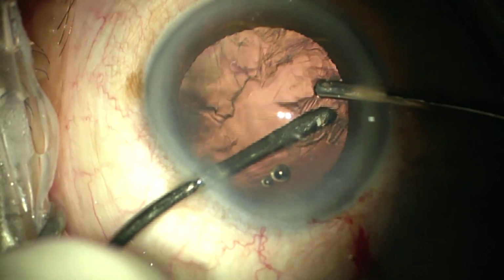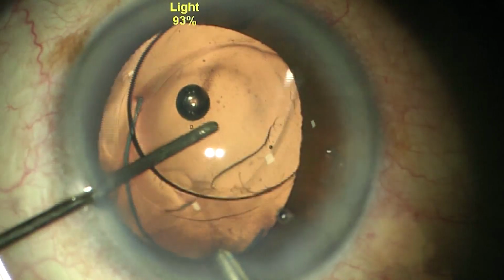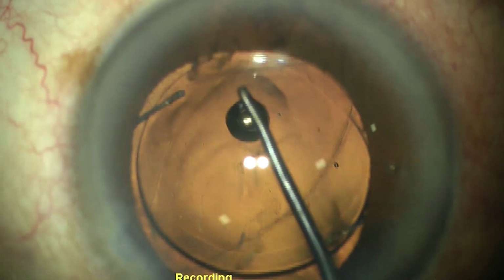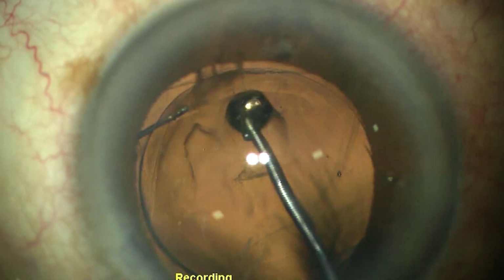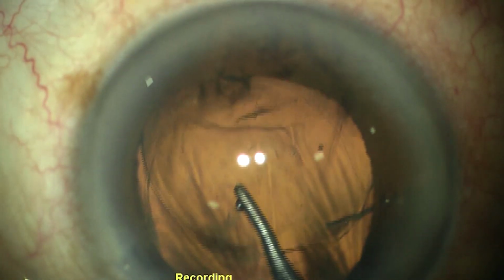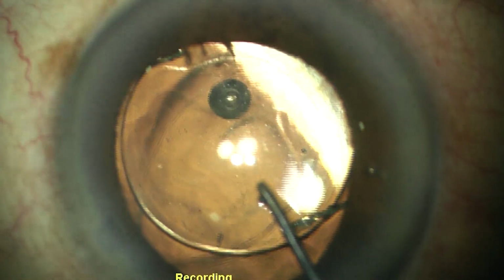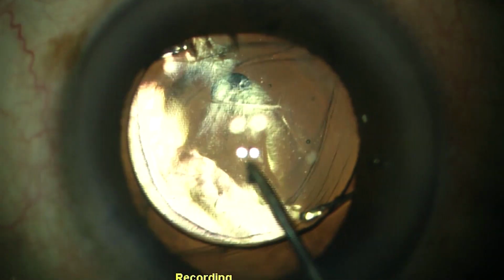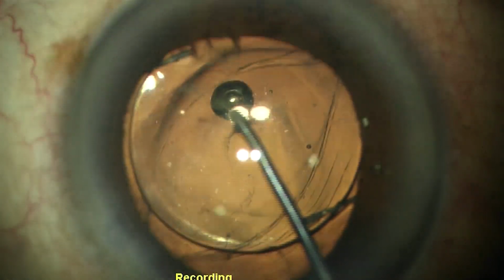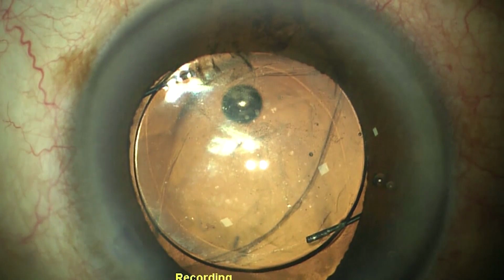the cortex and epinucleus and putting a multi-piece lens in the sulcus and capturing the optic of the lens into the capsulorhexis margin. This is called the optic capture, which ensures a long-term stability of the lens and also prevents UGH syndrome, since the IOL is located actually in the bag, the haptics in the sulcus.